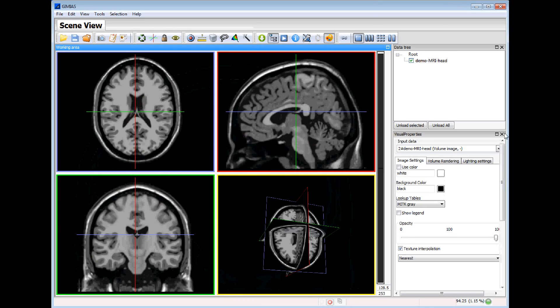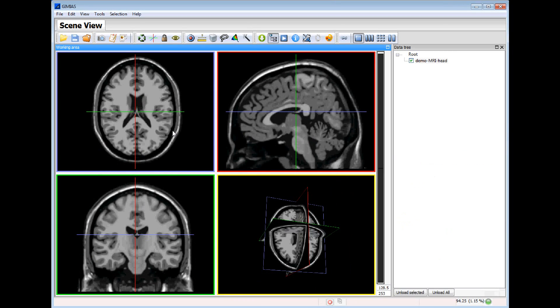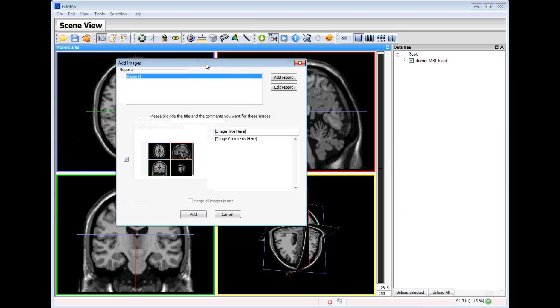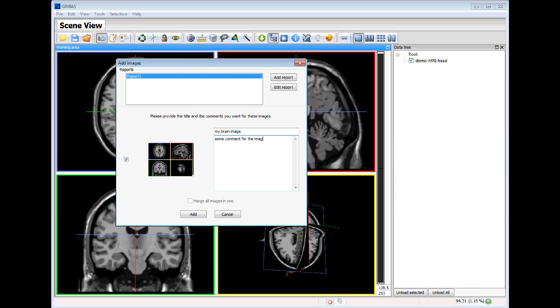And what we will do is to segment this image. So the first thing is to capture a snapshot of this image. This is my brain image. We can add some comments for the image.